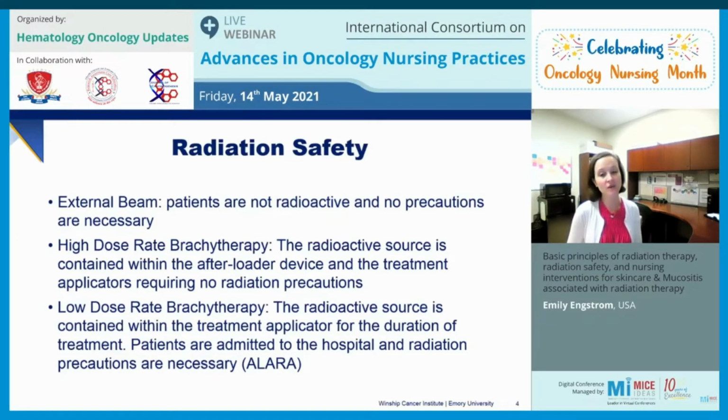When I started in radiation, the brachytherapy that we did, that type of radiation where we want to place radioactive seeds in the tumor or as close to the tumor as possible, we mostly did what was called low dose brachytherapy. This is where we actually did a couple of things. It's commonly known prostate seed implants, where we will place radioactive seeds actually within the prostate.